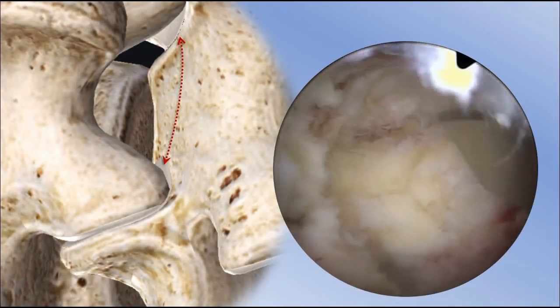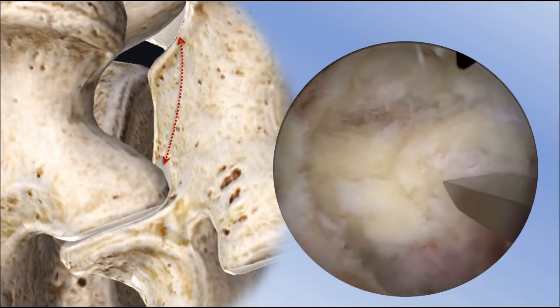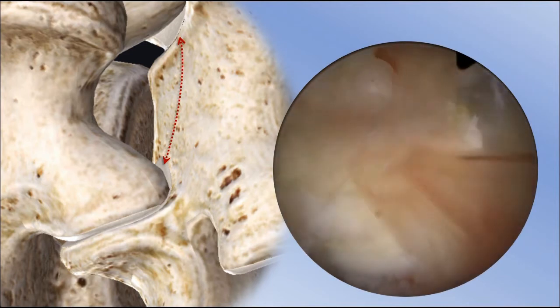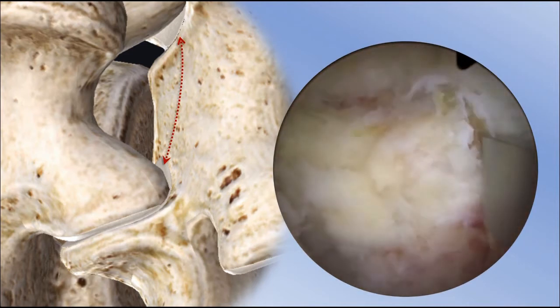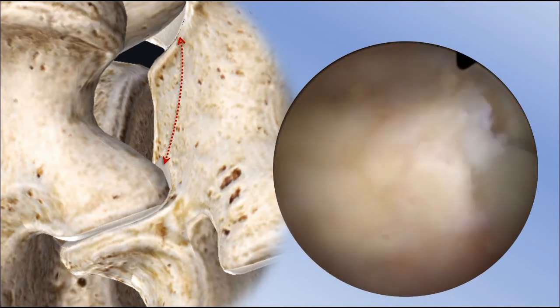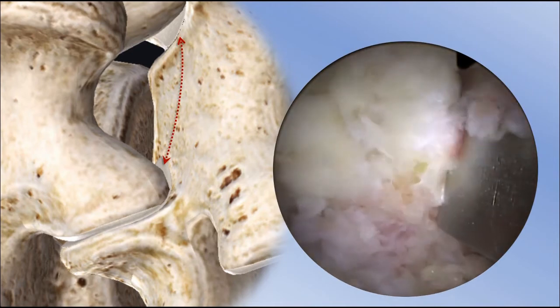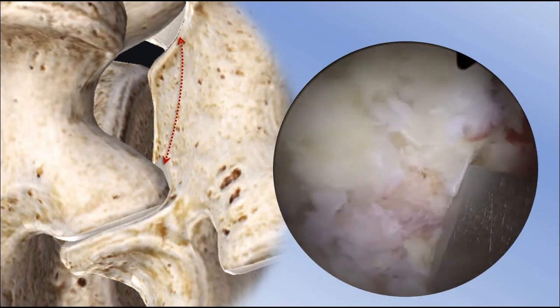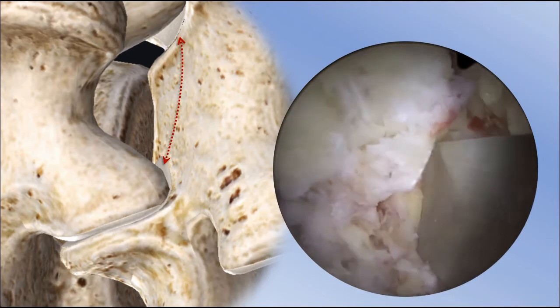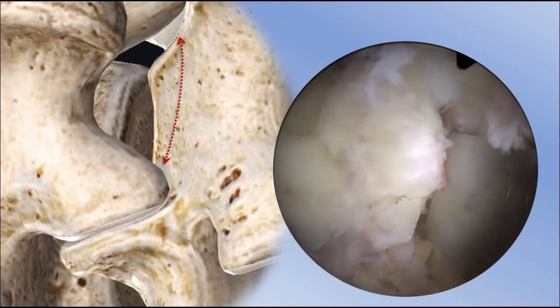Generally, this SP base portion has a very strong cortex. Make a long near-cortex breakage by several chiseling passes before making full near and far cortex breakage at one point. Near cortex breakage can make a crack to the far cortex. Then you can break the SP base safely without trying to chisel the far cortex too deeply. Do this exercise several times and you can learn how to do it.